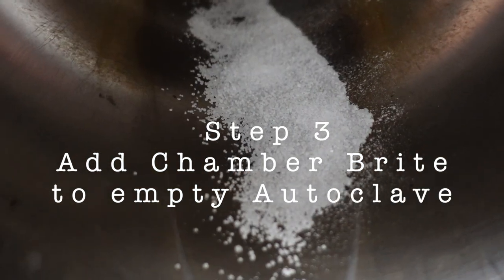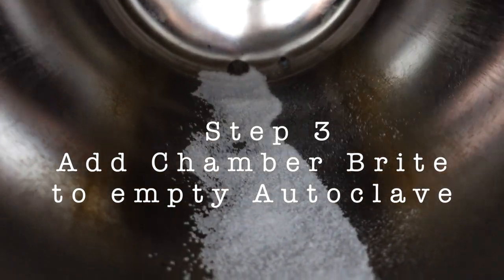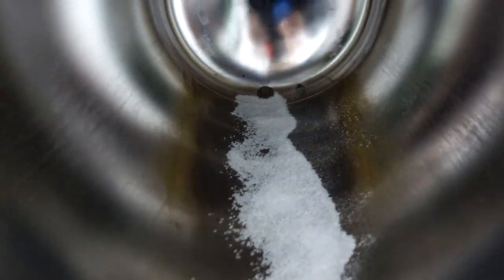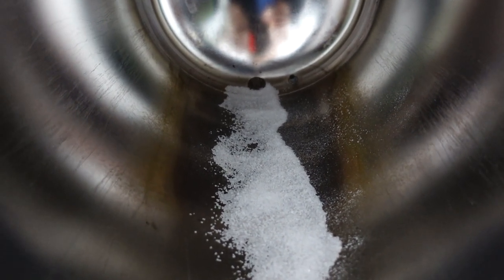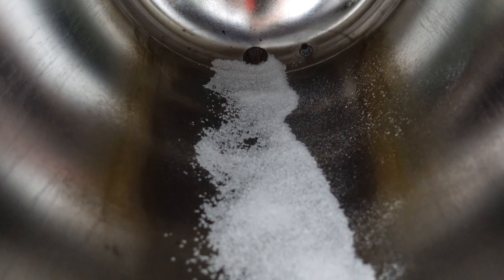This is the inside of the autoclave. I already put the cleaning stuff in. You can see it's really dirty and nasty in there. Normally it shouldn't be black like that.